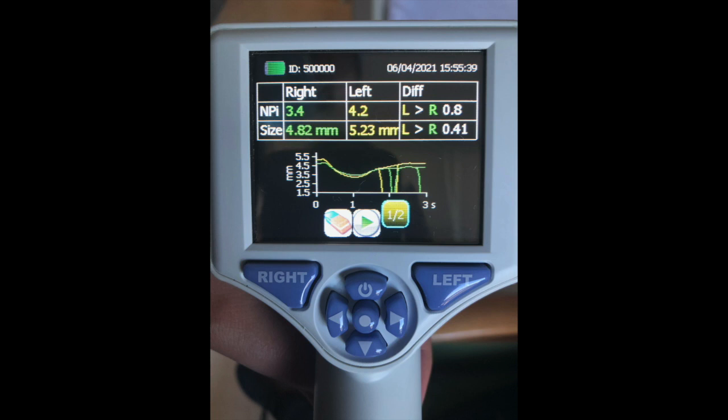A normal or brisk number is anything from 3.0 to 4.9. Less than 3.0 is abnormal or sluggish. If it is 0, the pupil is deemed non-reactive. Now, the pupillometer may also prompt you to do an additional reading if the NPI is 0. Also, if there is a difference between NPI, between the right and left pupils, of greater than or equal to 0.7, this may also be considered an abnormal pupil reading. The other row is showing the maximum pupil size in millimeters before constriction.